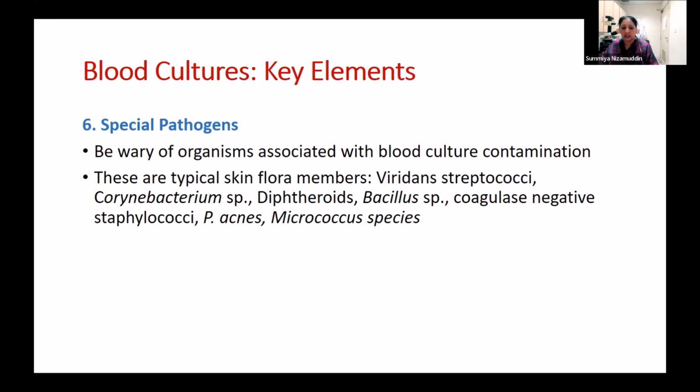हमारे पास जब भी ब्लड कल्चर के अंदर कंटामिनेशन आती है, हम नीचे एक नोट लिख के भेजते हैं. So it's always helpful for the physician to actually read that note, because उसमें हमने instructions दिए हुए होते हैं regarding whether this should be treated as a contaminant or this should be treated as a pathogen. Please read that information.